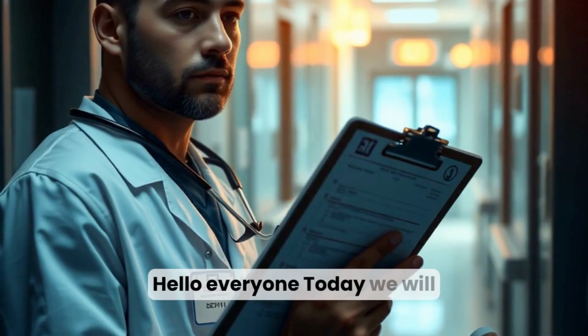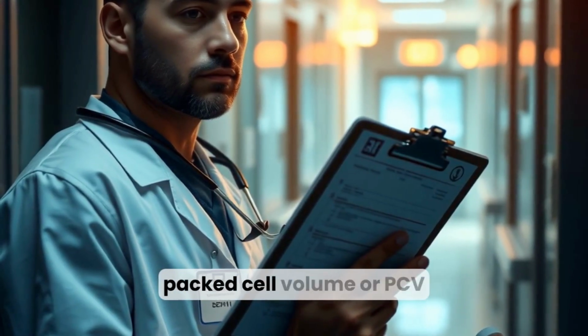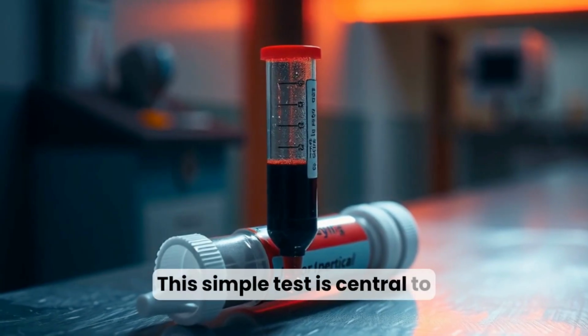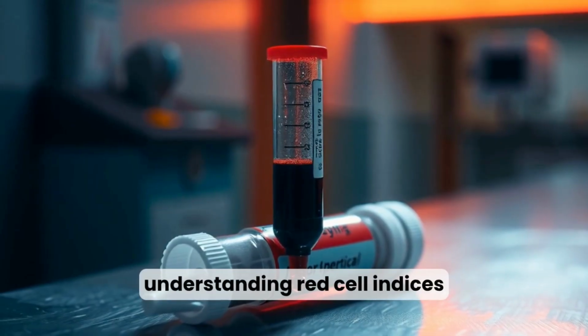Hello everyone. Today we will explore Hematocrit, also called packed cell volume or PCV. This simple test is central to diagnosing anemia and to understanding red cell indices.